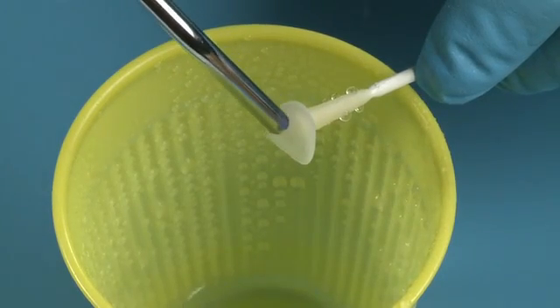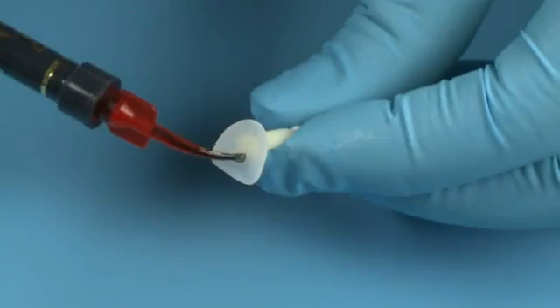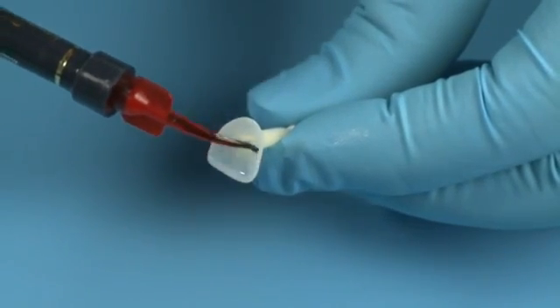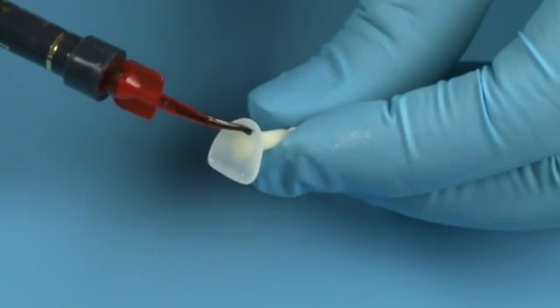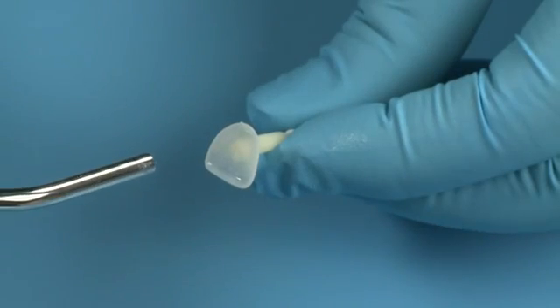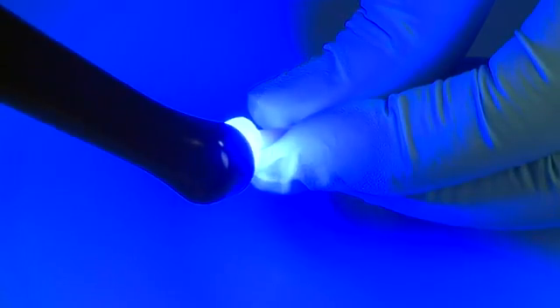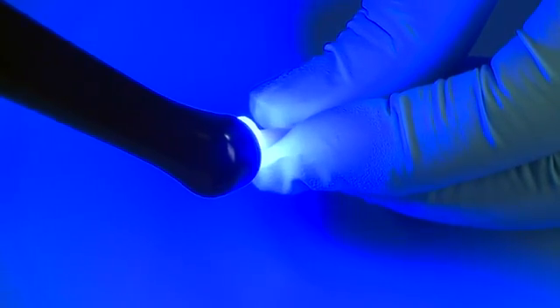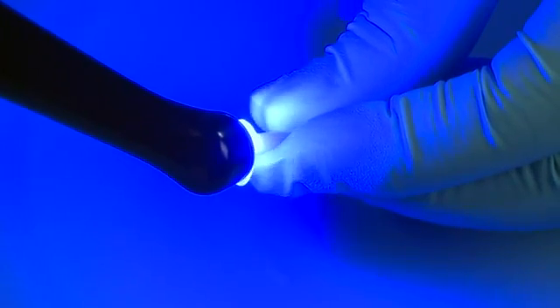If you use another etchant, follow the manufacturer's recommendations. Place Peak Universal Bond on the etched surface of the Edelweiss composite veneer and gently agitate for 10 seconds. Blow air using half pressure to thin and remove solvents. Light cure with Velo for 10 seconds on standard power mode, or 20 seconds if using a curing light with an output less than 600 milliwatts per centimeter squared.